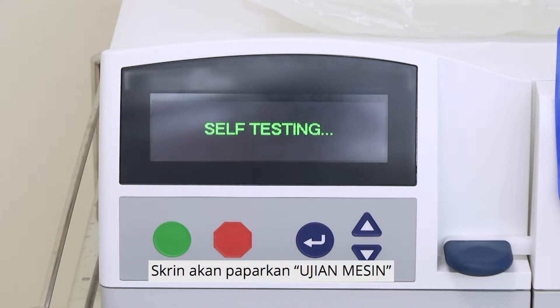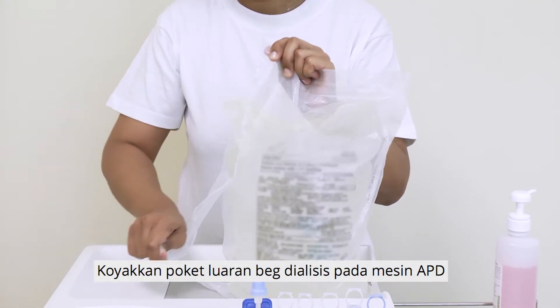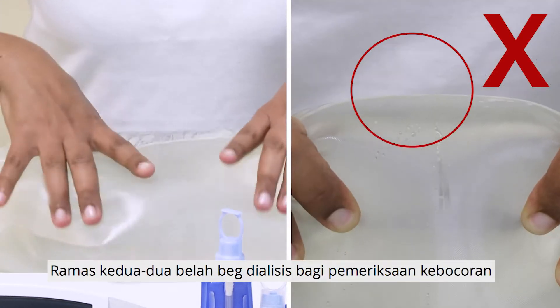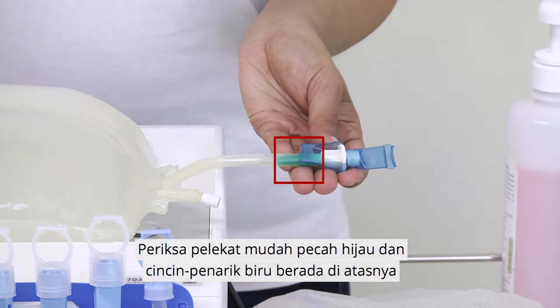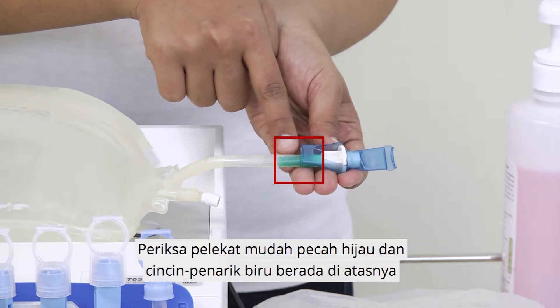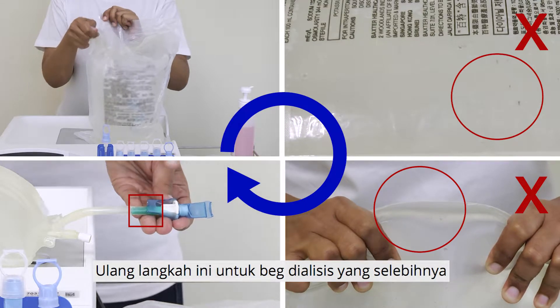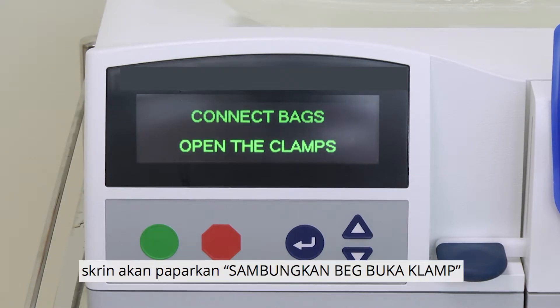The screen will show self-testing. Tear the outer pouch of the dialysis solution on the APD machine. Check that the dialysis solution is clear. Squeeze both sides of the dialysis solution to check for leaks. Check that the green frangible seal and blue pull ring are intact. Repeat these steps for the rest of the dialysis solutions. Once the APD machine has completed self-testing, the screen will show 'Connect bags, open the clamps.'